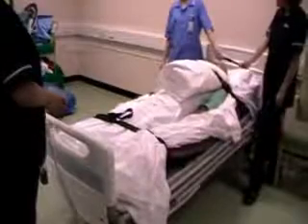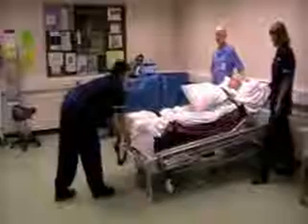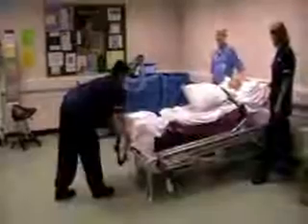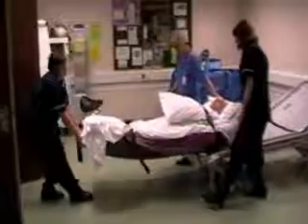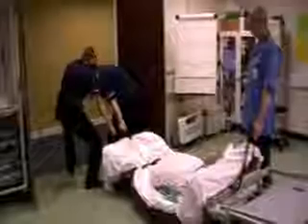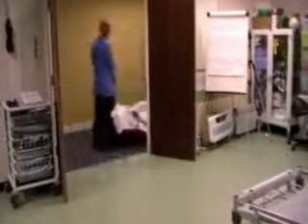Move the bed to its lowest level and tilt the foot down. Remove the end of the bed. Preferably, one handler should grasp the ski sheet loops at the end of the bed, grasping straps close to the pad, and bring the mattress onto the floor, lengthening the straps as you do so. Two people must take care to protect the head as it comes off the end of the bed. When off the bed, one person from the top helps the person at the foot end to move the patient towards the stairs.